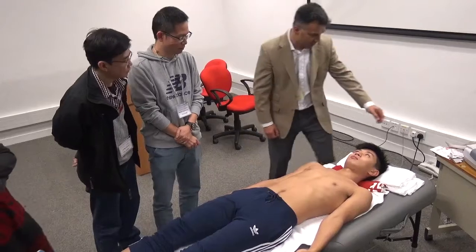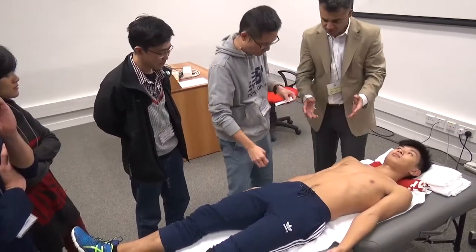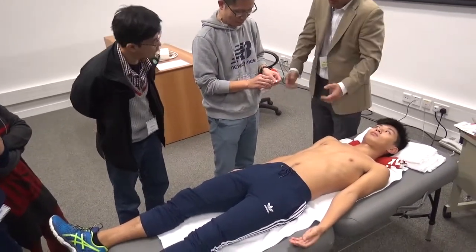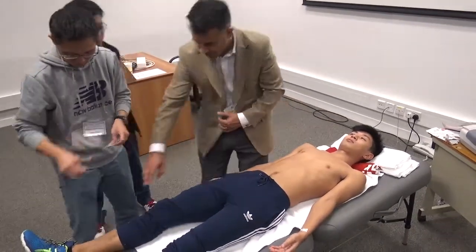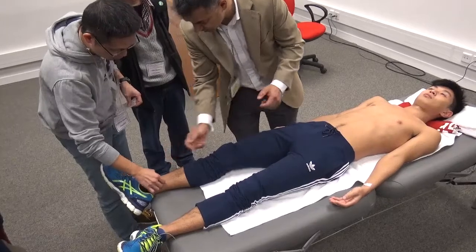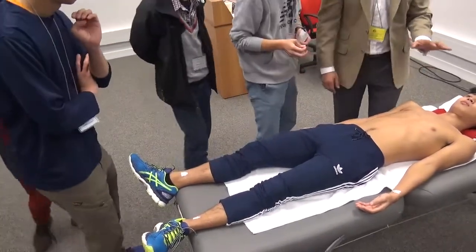Right. So if you want to just put these on first. So you've got these here. Okay, we've been using them. We're going to be using them again. So what we want to do is put them in bony prominences. Yeah. So again, the attitude that he's taken, don't twist him in some position because otherwise his muscles will be tense. So he's chosen to go like that. That's fine. Okay, good. And again down here, just a bony prominence. Anywhere along here is absolutely fine. Okay. What I would recommend is going upwards. Okay. Just the actual angle, sort of pointing upwards. So when the lead goes down, otherwise you don't want to go down at an angle. Yeah. The same for that one as well. So that's going upwards. Bony prominences. Okay, that's fine. Now for this one here, take your left hand, or stand on this side.